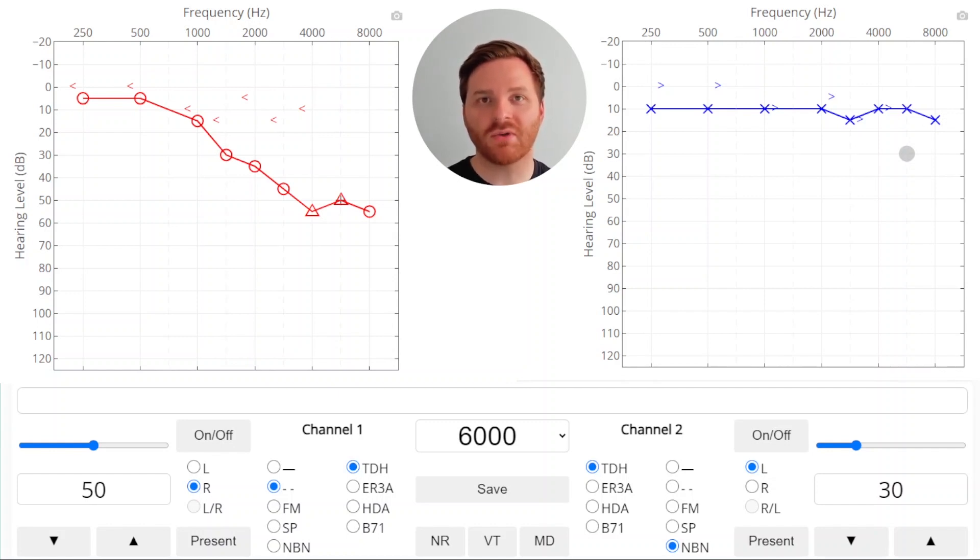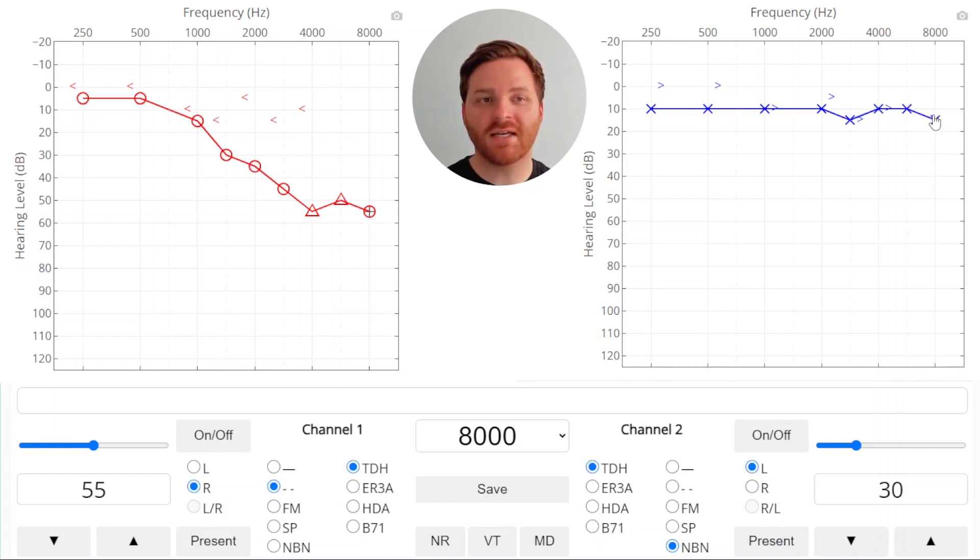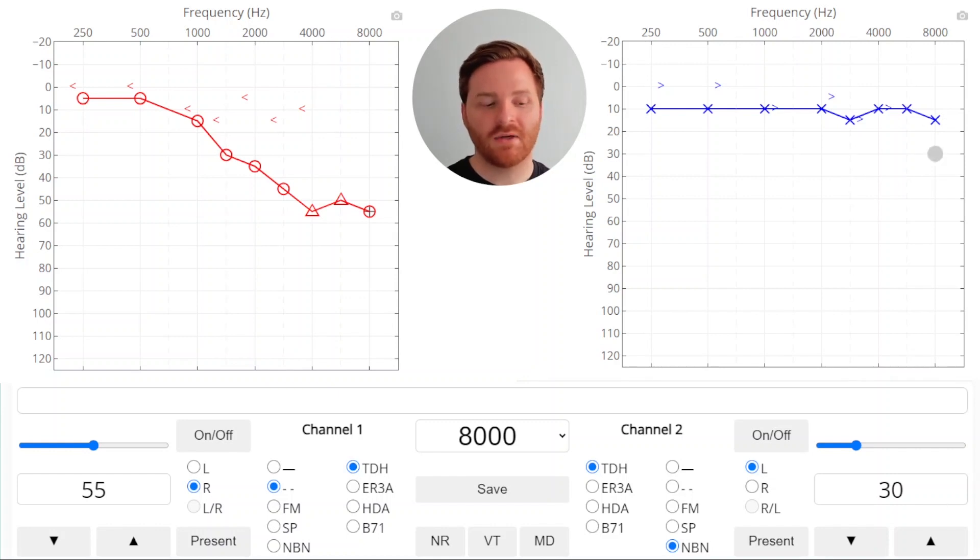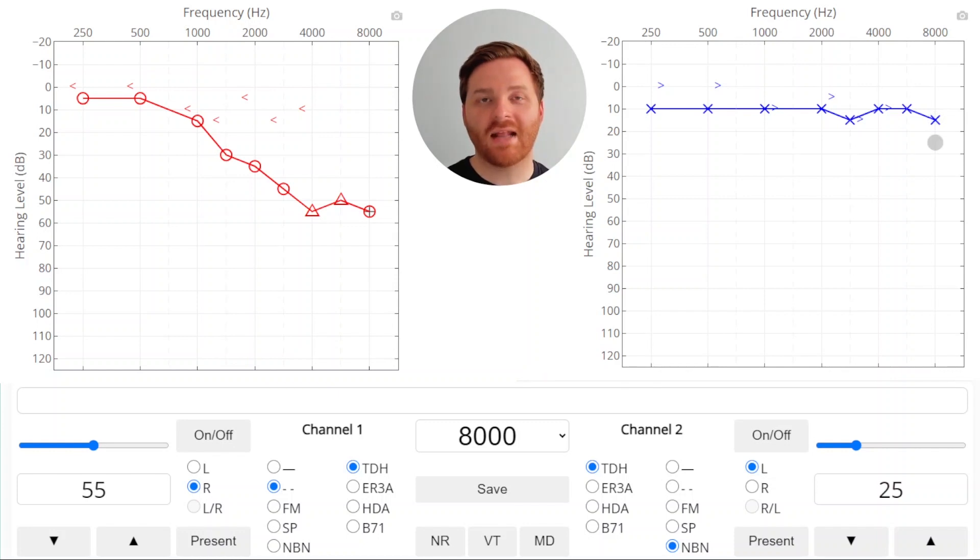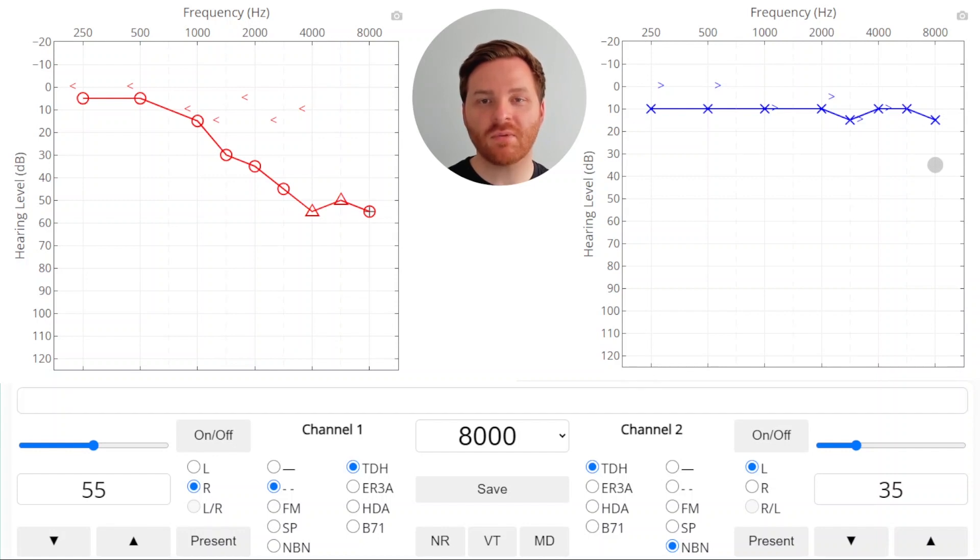We'll do the same thing for 8,000 Hz. A 55 dB HL sound would lose 40 dB of energy as it crosses over and be heard in the non-test ear at 15. 15 is also the threshold in that ear. So it's possible that our right ear threshold was found because the crossed over sound was heard by the great hearing in the left ear. So we need to mask. Turn on our masker and set the level to the air conduction threshold of the non-test ear and add a 10 dB safety pad. And we'll present. We've got a response so we'll raise the masker and a response so we'll raise the masker. Three responses and we'll save.